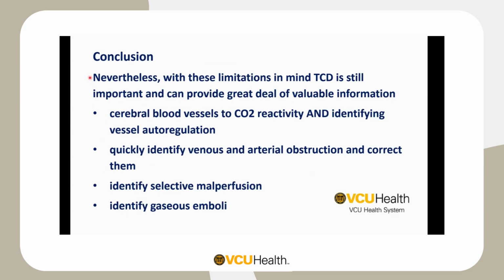Nevertheless, with these limitations in mind, TCD is still important and can provide a great deal of valuable information, such as cerebral blood vessel CO2 reactivity and identifying vessel autoregulation. We can talk more about how we do it in our surgical room. It quickly identifies venous and arterial obstruction, and we can correct it. It identifies selective malperfusion and gaseous emboli.